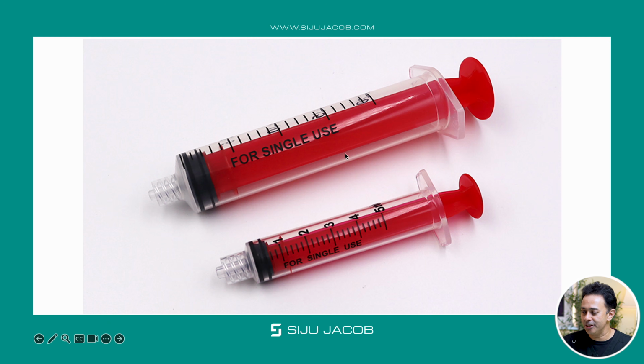And like I said, it's always a good habit to use these sort of red syringes. So even the assistant, when he or she passes the syringe filled with sodium hypochlorite, they're aware that it is hypochlorite. So you pass it in such a way that even a drop doesn't fall on the patient's dress and kind of damage it irreversibly, especially if it's an expensive dress.